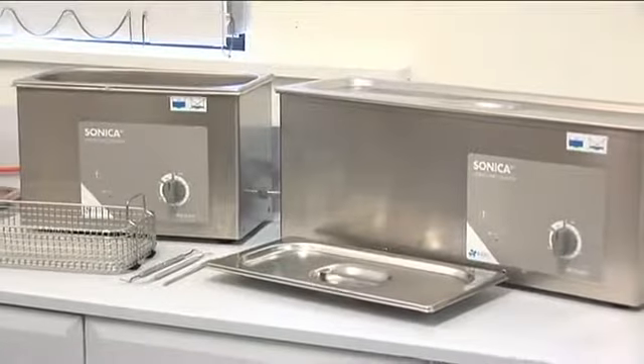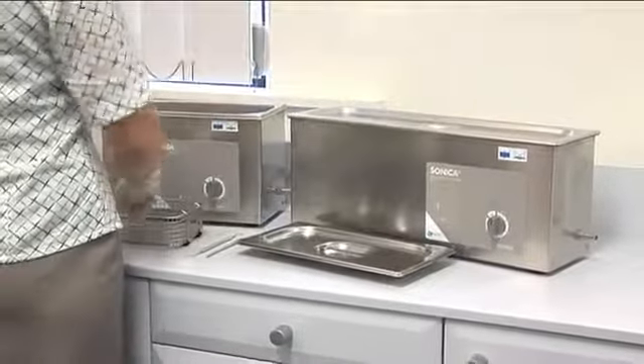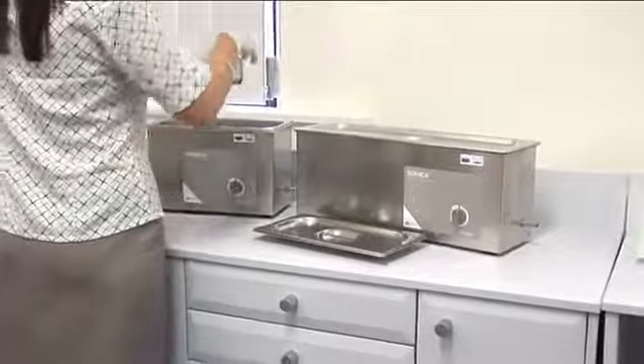Sizes range from 1.4 litre tanks up to 90 litre, with the most popular being the 6 litre, 6 litre long, and 9 litre models.